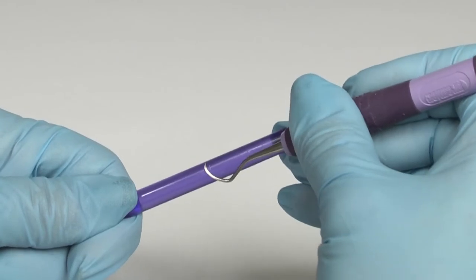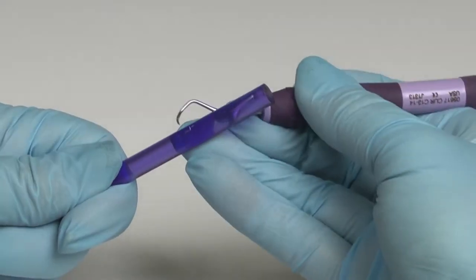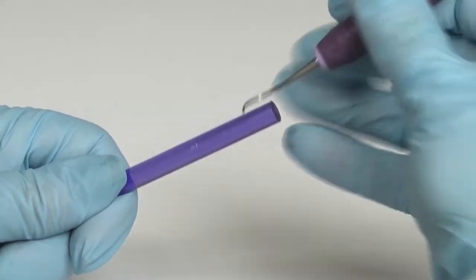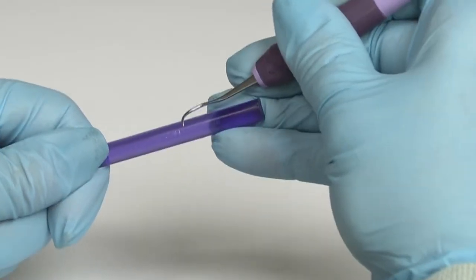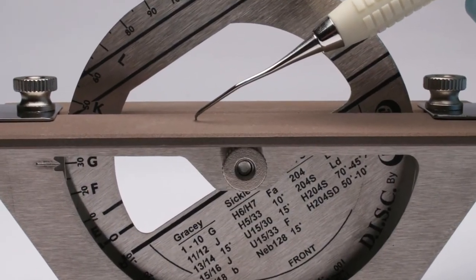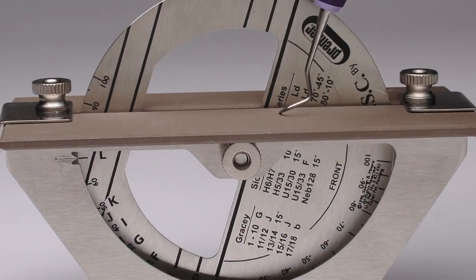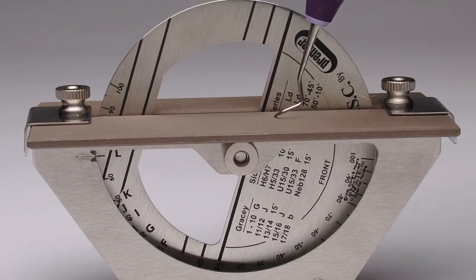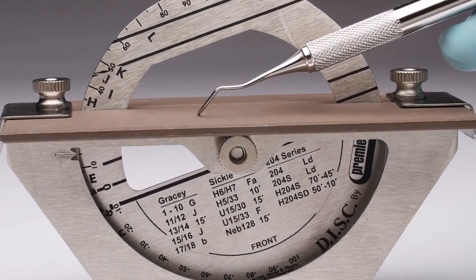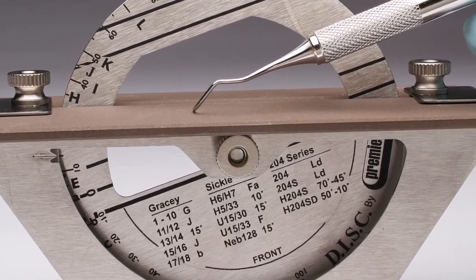Finally, take a test stick and apply the sharpened cutting edge to the stick to check for bite, as this indicates a successfully sharpened instrument. Regardless of whether you are sharpening a Columbia 1314 or more complex designs, the disc gives you complete confidence you are sharpening each instrument correctly for predictable, efficient results in clinical use.